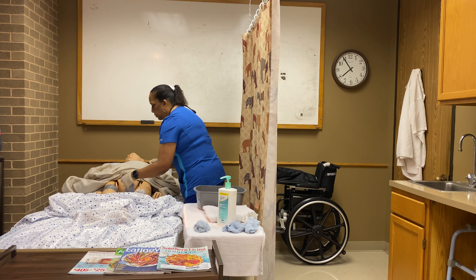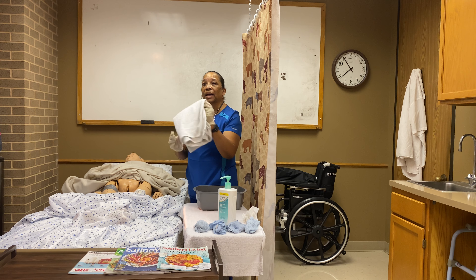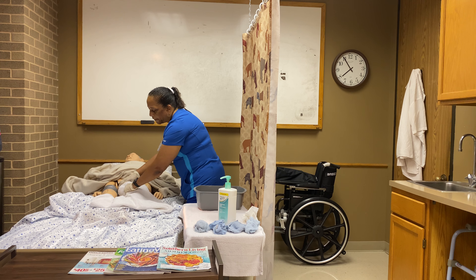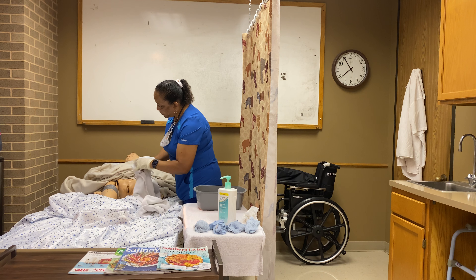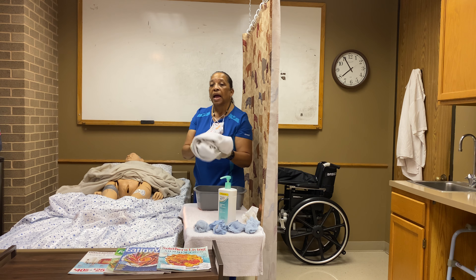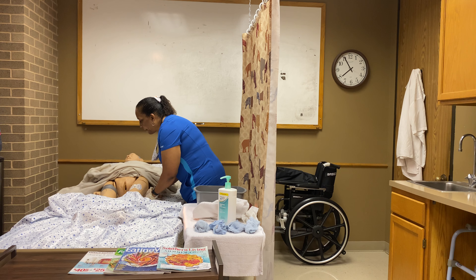Now I'm going to rinse — center, fold over one side and come down, other side come down, groin come down, opposite groin come down. Now I can dry. I'm going to start by drying the catheter — place my hand, hold at the meatus, and dry the catheter. Then I'll pat dry around the vaginal area, making sure I get the groin.